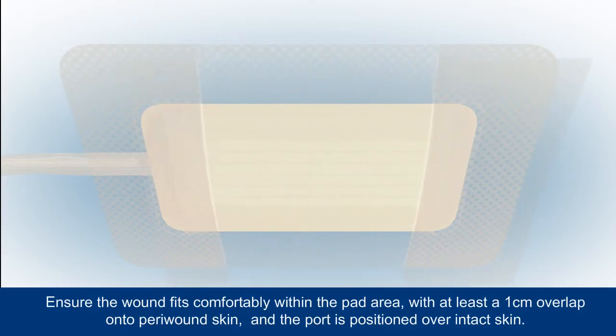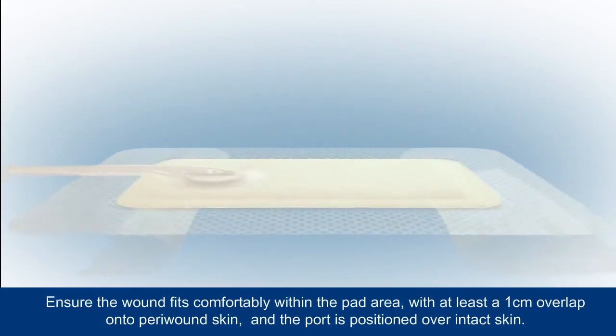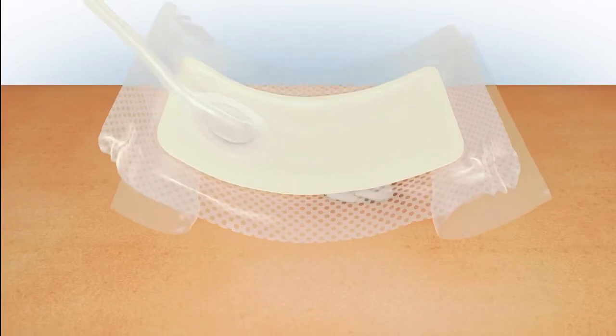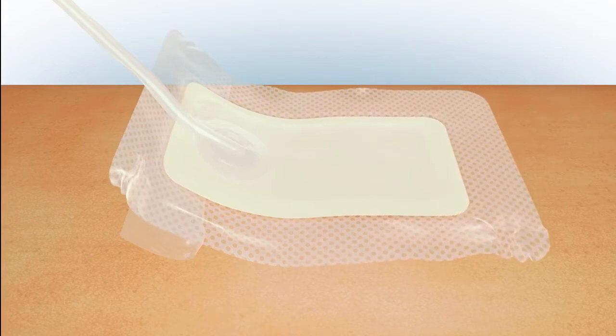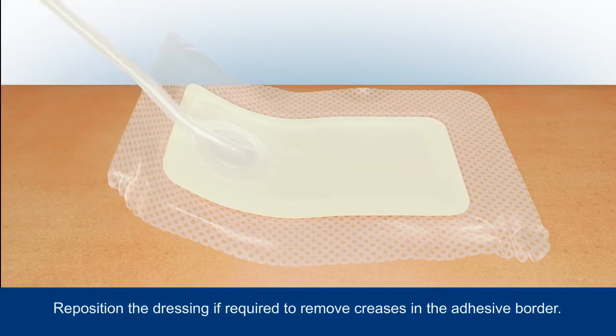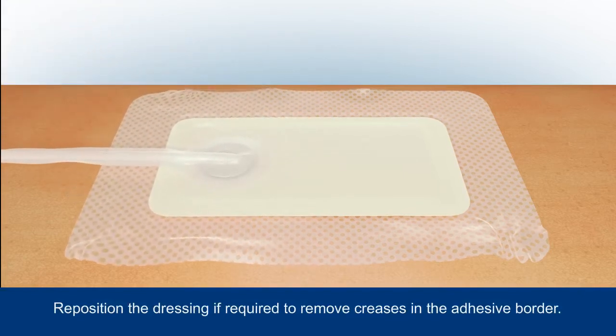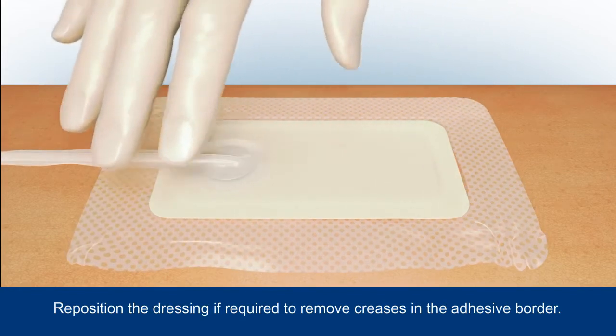Place the dressing centrally and flat over the wound and surrounding skin, making sure that the port is positioned away from the wound and is uppermost over intact skin. It's important that you don't place the port directly over the wound. Remove the remainder of the backing and carefully smooth the dressing borders around the wound, securing it in place. Avoid creasing the adhesive border, but if this happens, simply reposition.